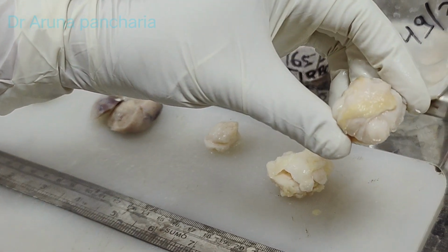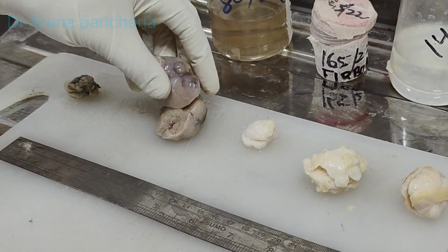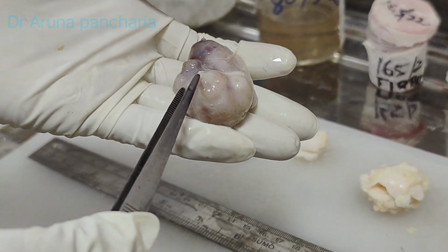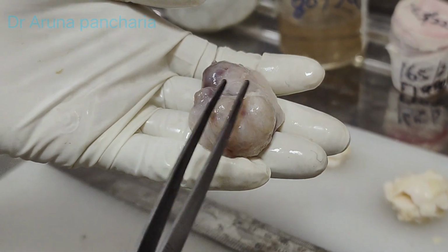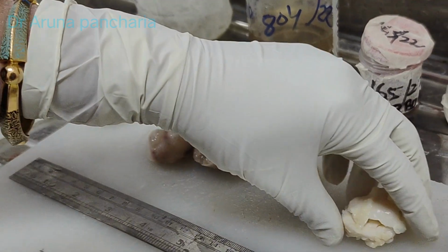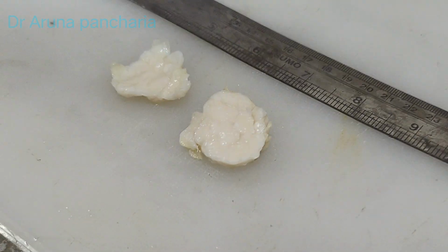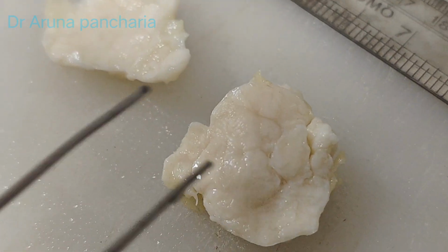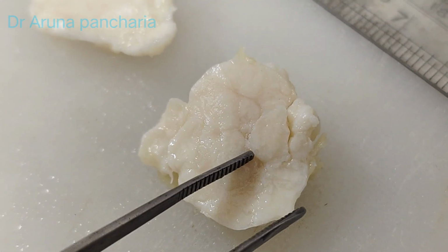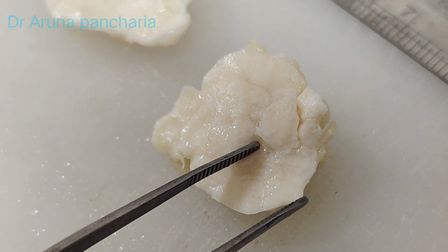There is no true capsule seen over it, and sometimes you can see the bosselated surface because of the projections. On the surface of it, there is a rounded protuberance you can see. After cutting, the cut surface is seen as a grey-white firm area, and you can see the slit-like spaces. These slit-like spaces are because of the compression of the ducts by the stroma.